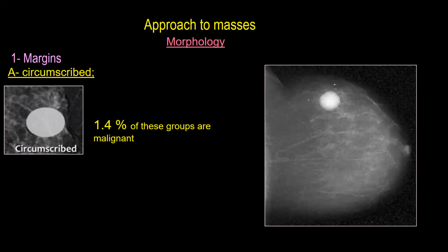So again, remember, Sumaya? Are you there? Yes. Okay, give us the differential diagnosis of 1.4 as a reminder. We brought it again as a reminder so as not to forget.